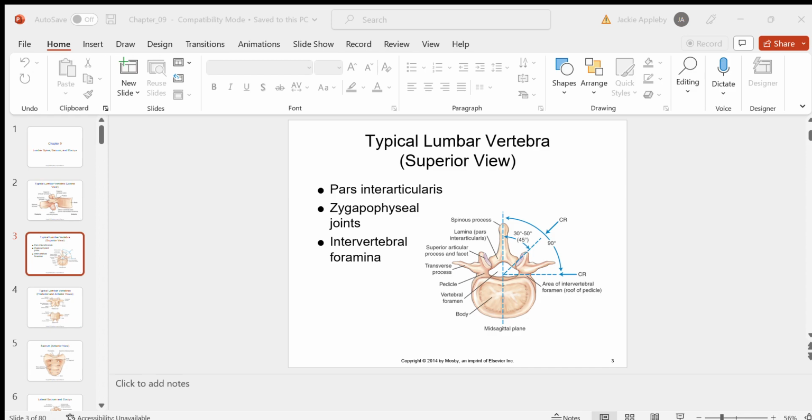I came up with a simple way to figure it out. If you make a cross section, four corners, the RAO in the top, and then LPO in the bottom right, and then they're opposites. Exactly. And I do a similar thing. In my head, I'm just drawing a straight line between that position and that position. It doesn't matter which one I put them into, I'm going to show that joint space, because that straight line runs right through that joint space. The LPO position and the RAO position both draw a straight line through that joint space.